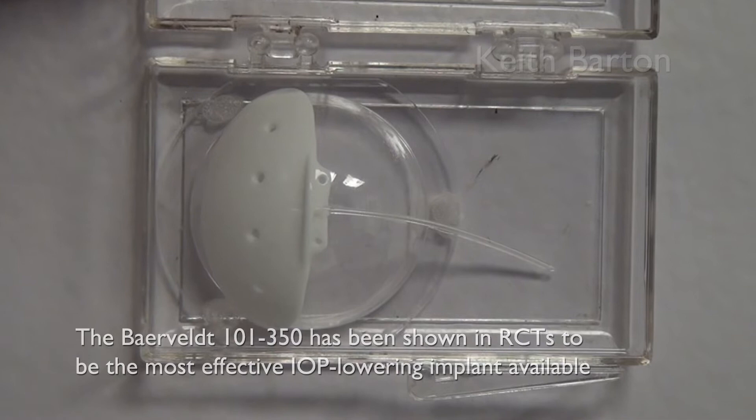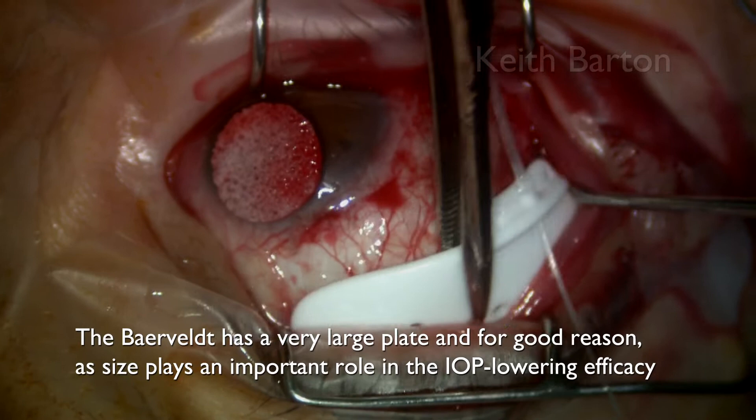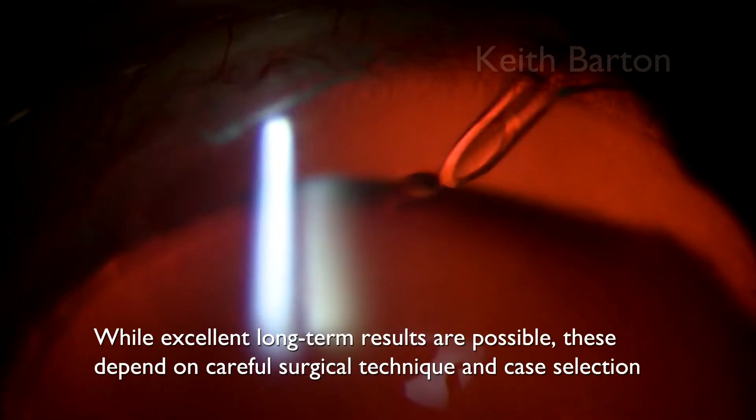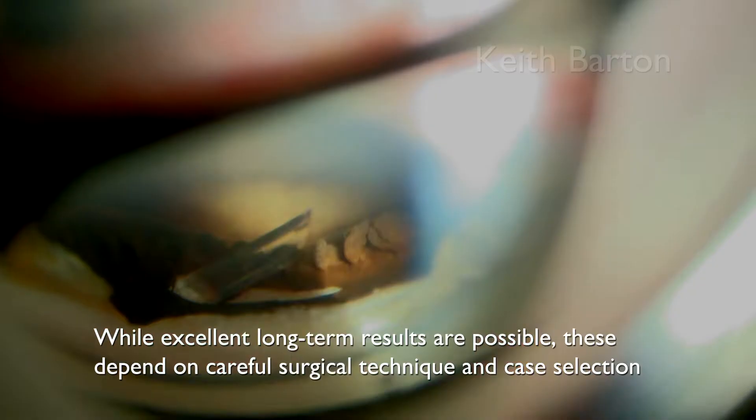The Baerveldt 101-350 has been shown in trials to be the most effective IOP-lowering implant available. The Baerveldt is a very large plate, and for good reason, as size plays an important role in the IOP-lowering efficacy. While excellent long-term results are possible, these depend on careful surgical technique and case selection.